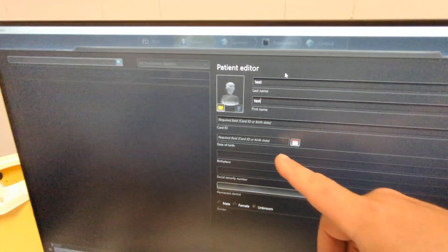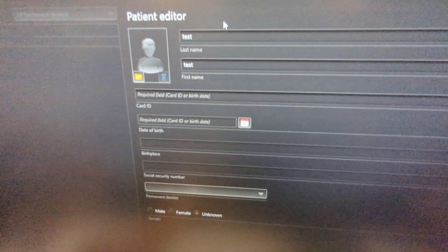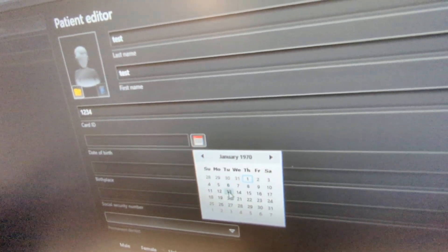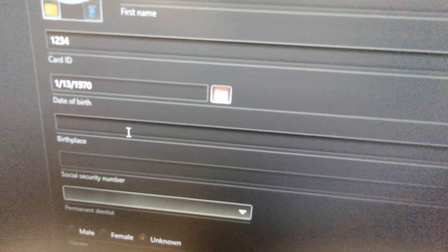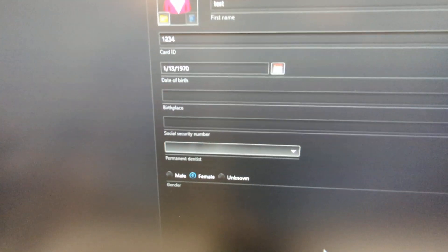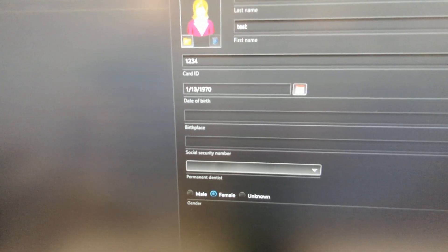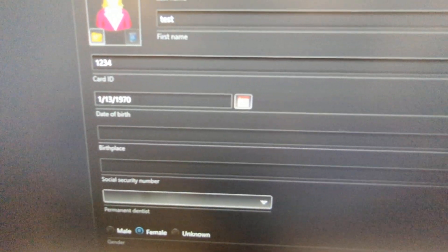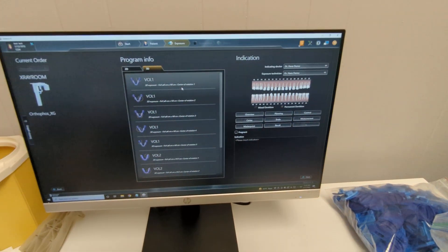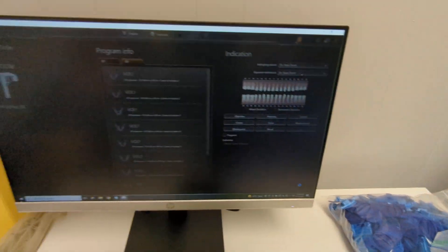Card ID can just be a random number or a chart number. Then date of birth — click it. You would have to do this for every 3D or pan patient. It's going to integrate from EagleSoft eventually. Hit Save. Then hit that little x-ray machine icon. Hit Next — you don't have to worry about any of this, just hit Next and it's ready to go.